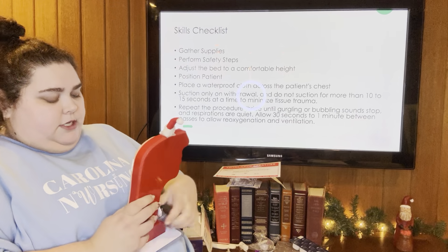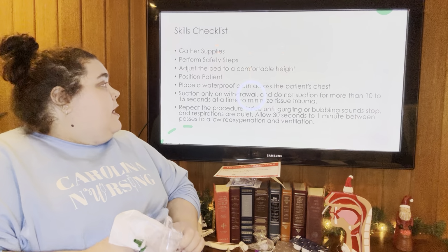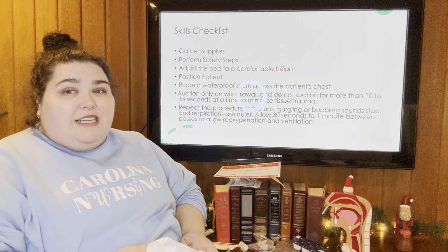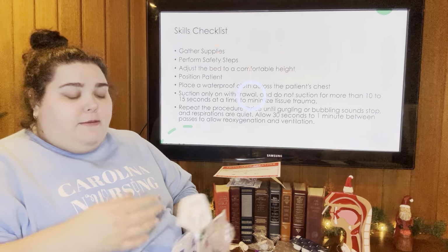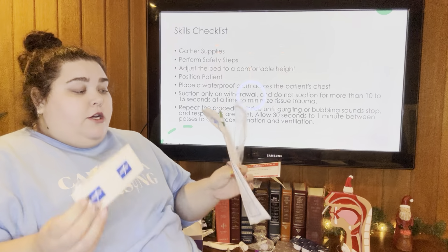You want to always perform your safety steps, make sure it's the right patient, make sure your settings are correct, things like that. Then you're going to want to adjust the bed to a comfortable height and position your patient comfortably. You'll put a towel or something waterproof on their chest just in case they have a lot coming out of the trach. You don't want to get them gross. Then you're going to set things up.